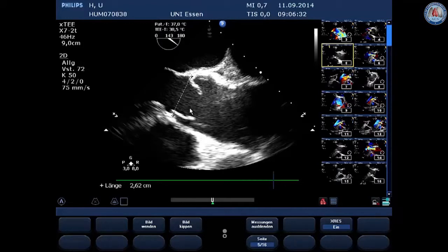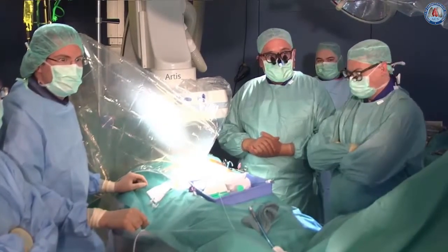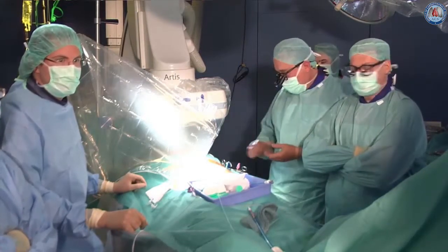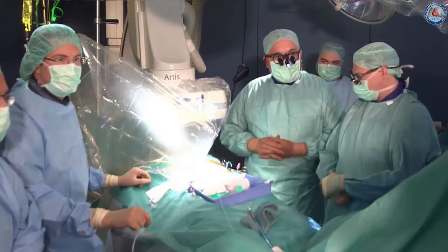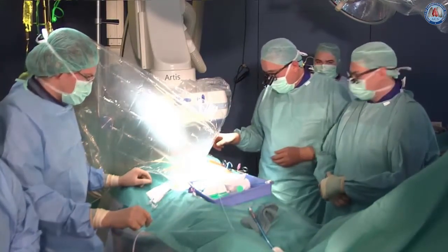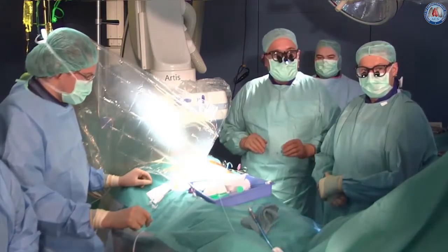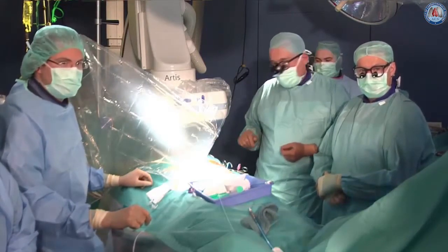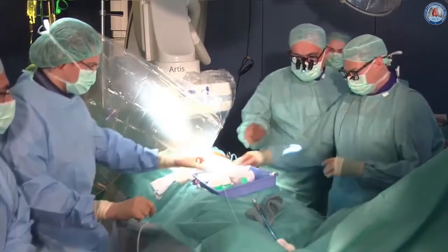So you see, this is a quite tricky case. The valve is absolutely not calcified. Professor El Khoury told us that he doesn't like calcium to do aortic valve repair, but we, as TAVI operators, we usually like calcium very much. But in this case, we don't have any calcium at all. And our strategy is to do, via the transapical access, a Symetis Accurate TA transapical valve. So I think we should start.